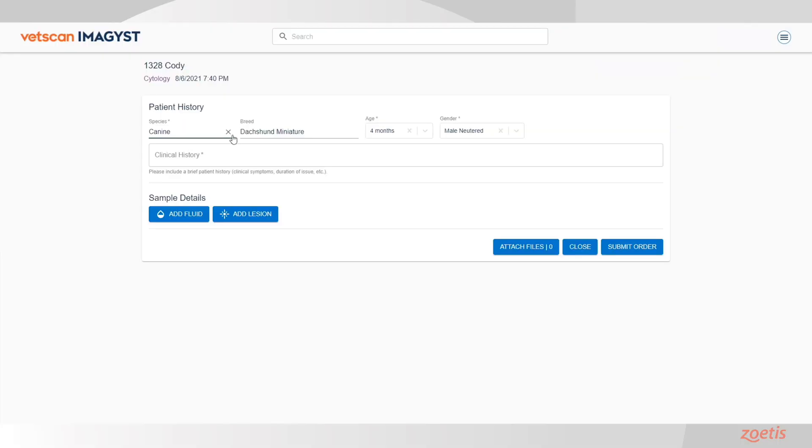Next, enter information for the patient's breed, age, and gender. The patient's species is already set. Include a brief clinical history.